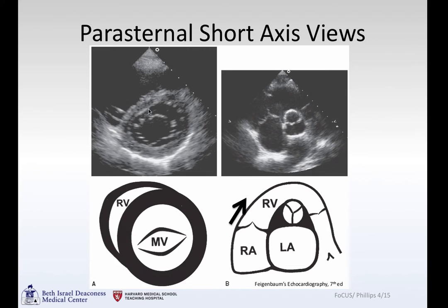Short axis at the level of the mitral valve — here's your mitral valve opening and closing. A little bit further basally: the aortic valve with three leaflets, tricuspid and pulmonic valves. As you're in this view, the marker is pointing off in this direction. Be careful when doing these views not to be off-axis.